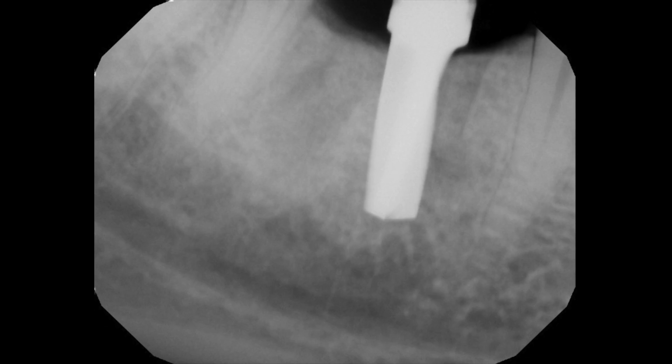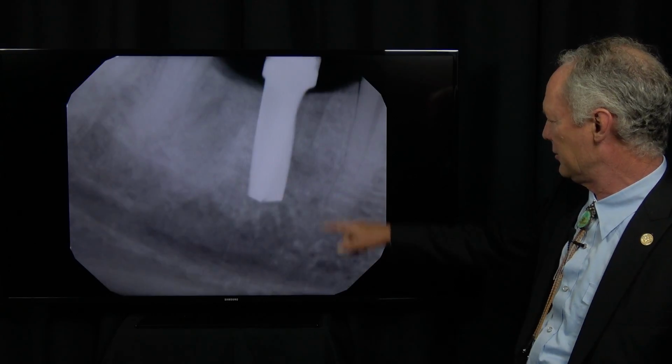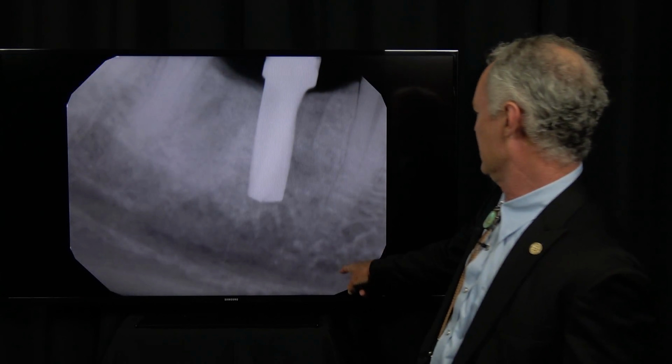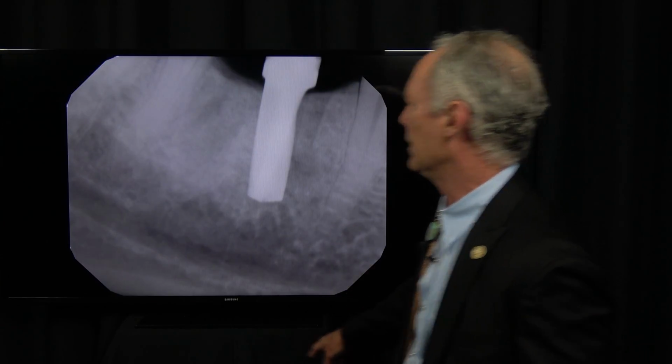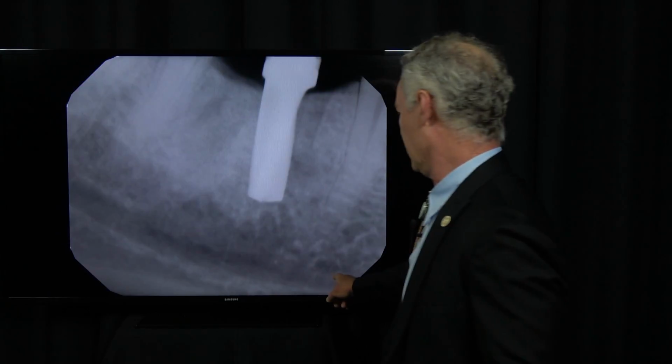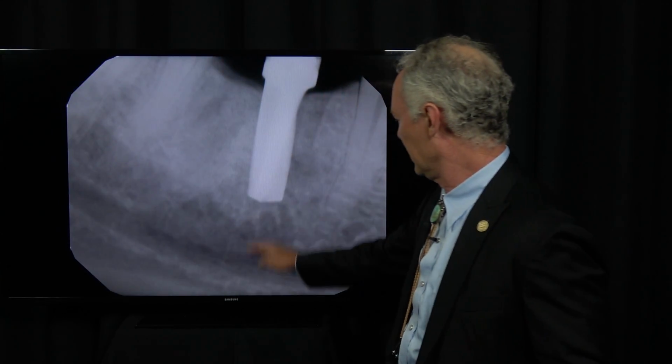And then I'm going to take another periapical radiograph of this drill. And you can see here's the tip of this tooth right here, and the tip of this tooth right here. Here's the inferior alveolar nerve right here. So we've got plenty of space.